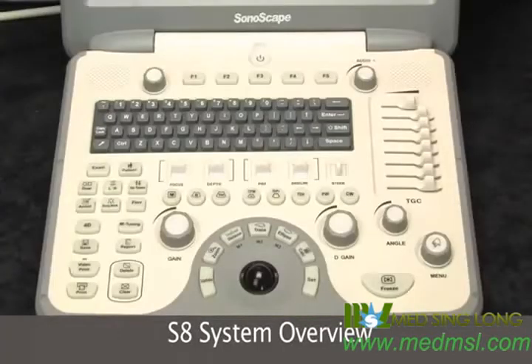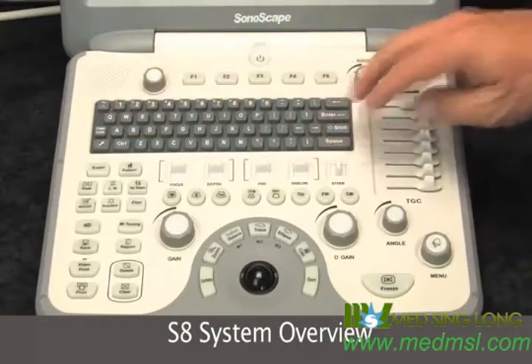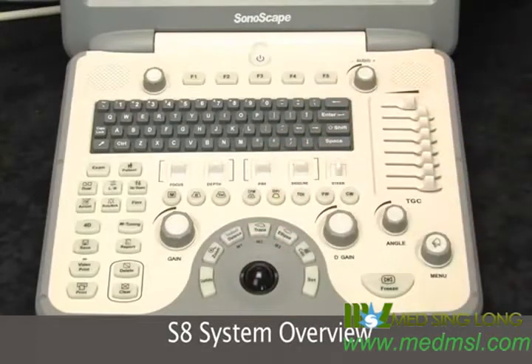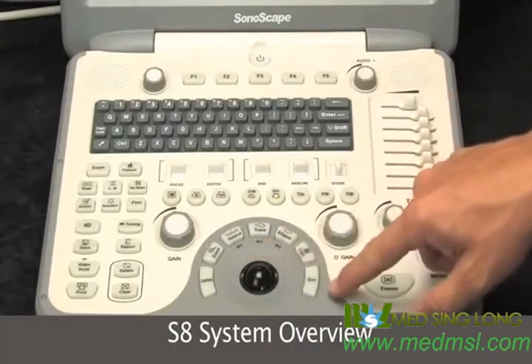The keyboard is very logically laid out. The QWERTY keyboard is almost full size and it's very easy to function. It's all set up around the trackball — this is where your hand will be most of the time. Your trackball functions are the trackball and the set key; they're the ones you'll use the most.